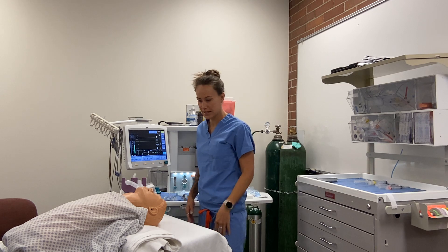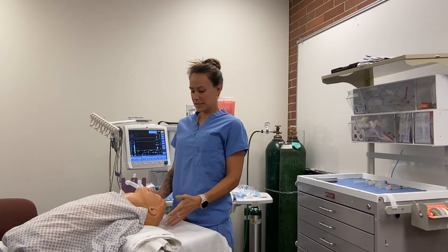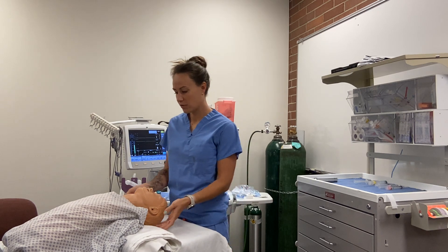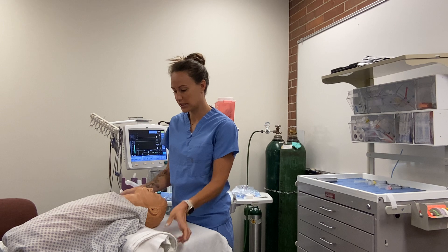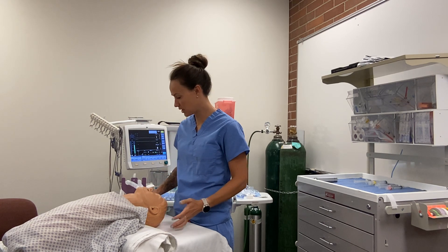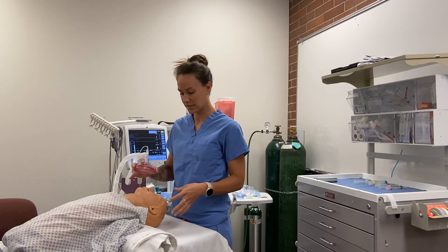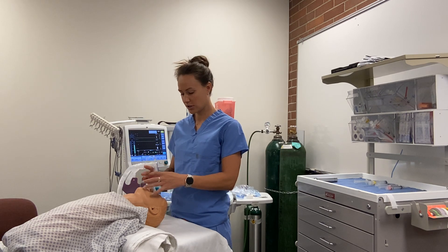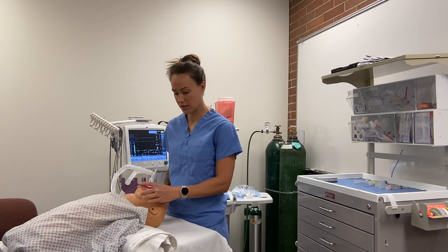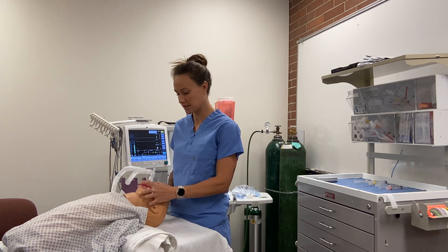For this patient, he's going to come into the room. Since this patient is cooperative, we're going to lay them down on the bed. We may put a shoulder roll under just to help with positioning and put their head in a sniffing position. We're going to take our mask and use the CE technique — thumb and forefinger holding the mask to their face, and the other three fingers holding the bony part of the jaw, pulling it up towards the mask.